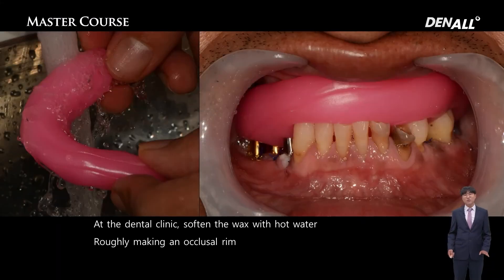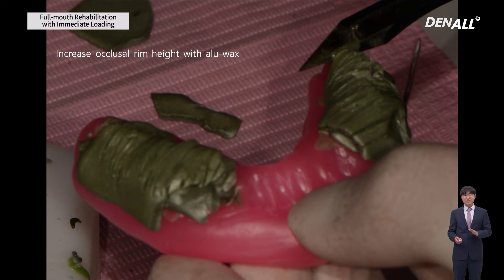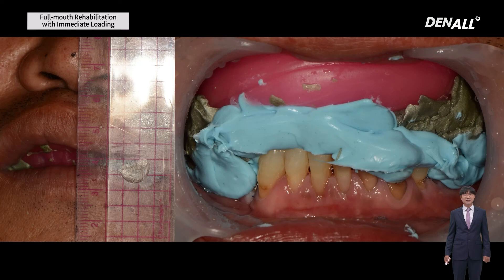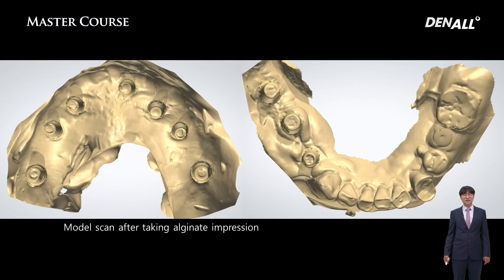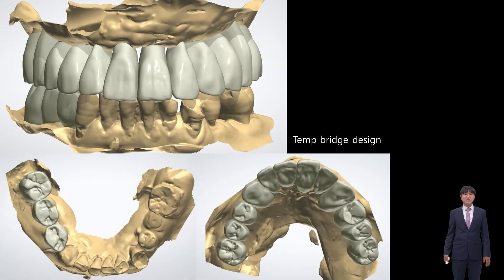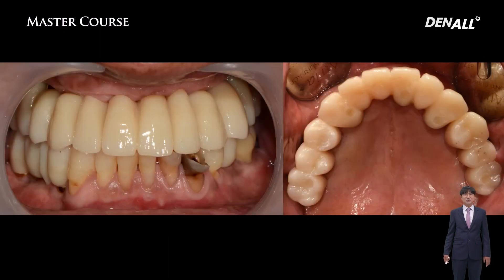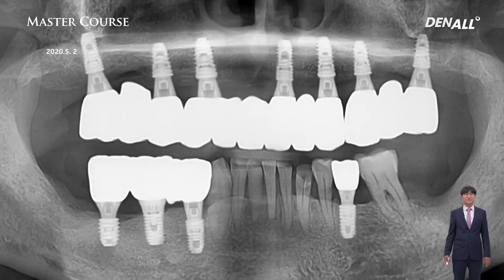The wax is softened with hot water and the patient bites on it. Physiologic rest position and height differences are compared. Using yellow wax, the rim height is increased to be in the 2–4 mm range from the physiologic rest position. During the temporary phase, CR was taken 1 to 1.5 mm lower than the physiologic rest position, considering continuous occlusal adjustments — acquired with a slightly higher VD. CR acquisition is completed. Model scanning is performed after taking an alginate impression. In the lab, after mounting on the semi-adjustable articulator, the bite relationship was scanned with a model scanner. A temporary bridge was designed — as one guide was used, the placement paths were appropriate, so a one-piece temporary was fabricated. Final prosthesis and final panorama x-ray.